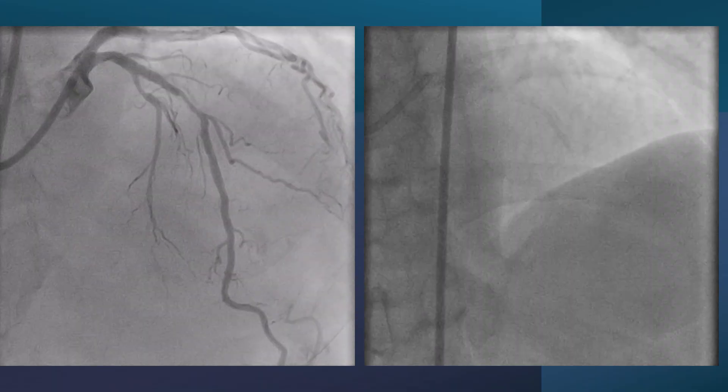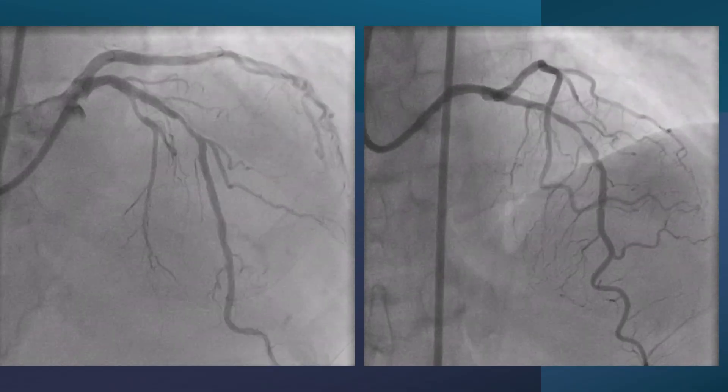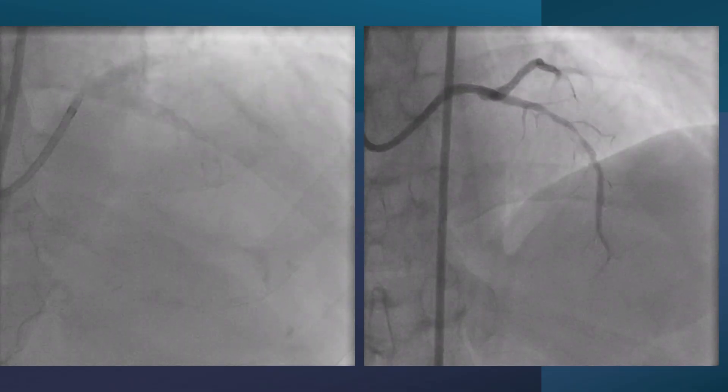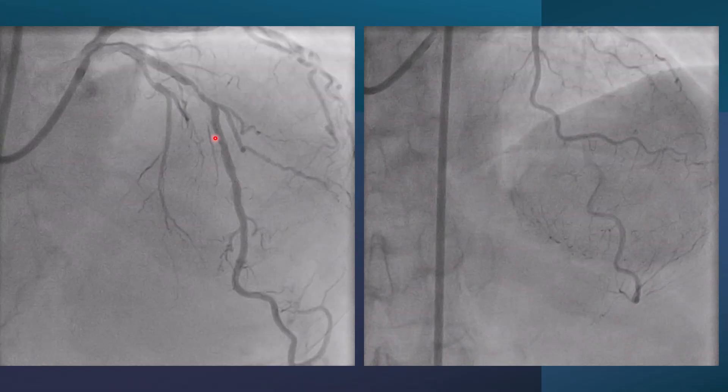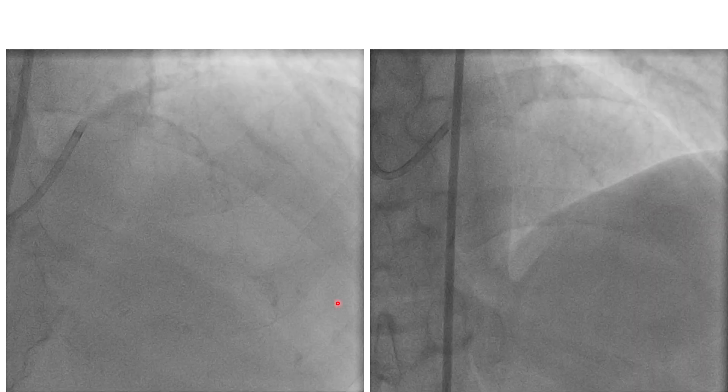Here we put both angiograms side by side. They are nearly similar, although maybe at different magnification, and the calcification is evident. If we look only on dry fluoroscopy, we can see in the first case calcifications are present on both sides of the artery, and also in the other one. These are signs of moderate to severe calcification.